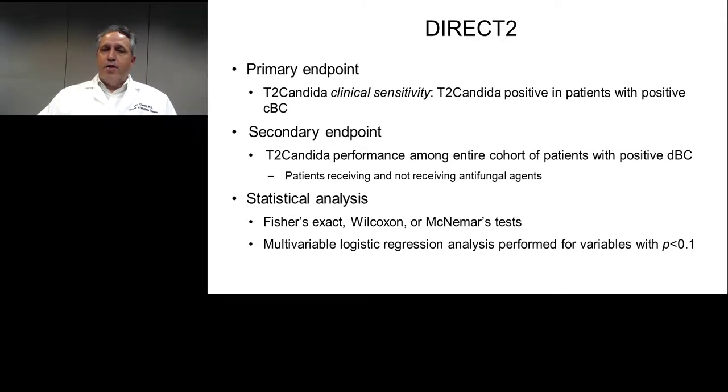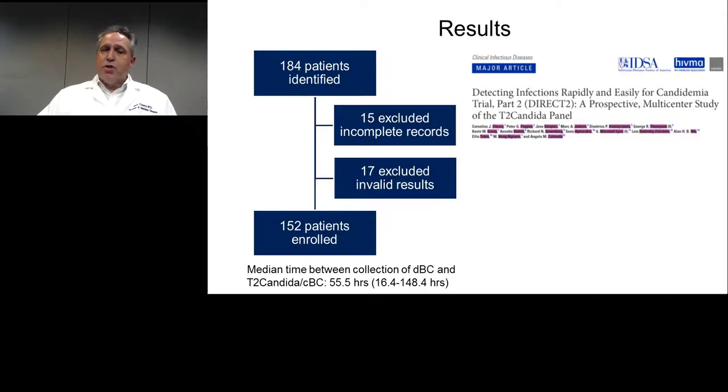And here are the results. So after exclusion, 152 patients were enrolled, as shown here on the left. And the median time from collection of the original diagnostic blood culture and then the collection of the subsequent T2Candida paired companion blood culture was 55 hours.